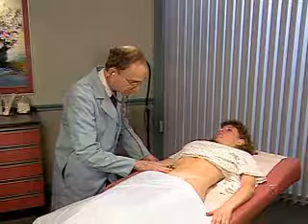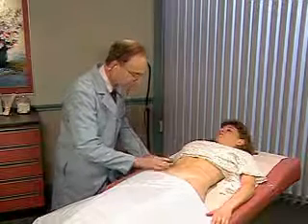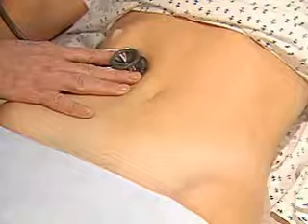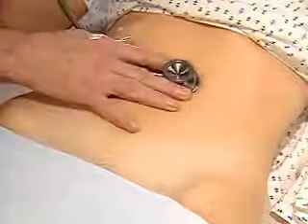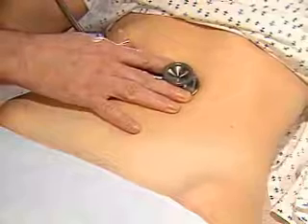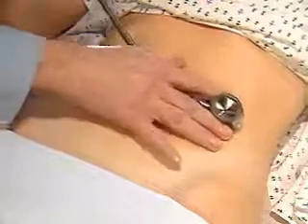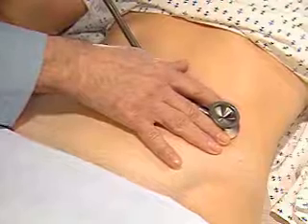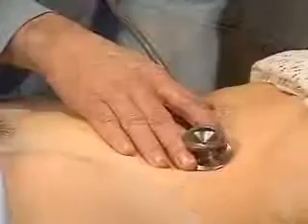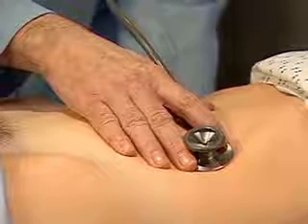If the patient has hypertension, listen for bruits over the right renal artery, aorta, and left renal artery. If present, a bruit would sound like this.